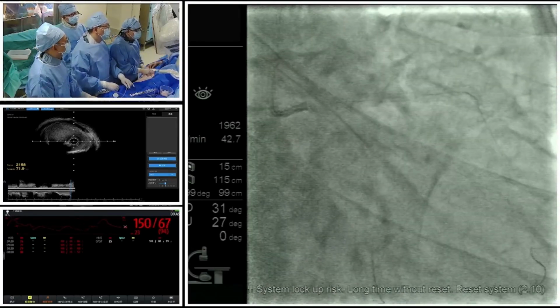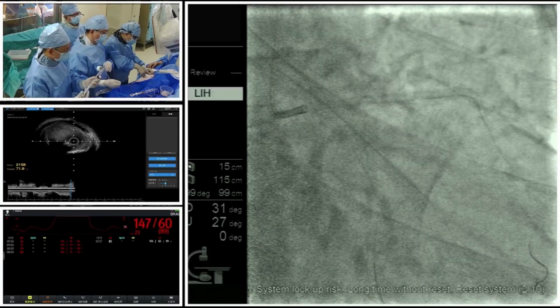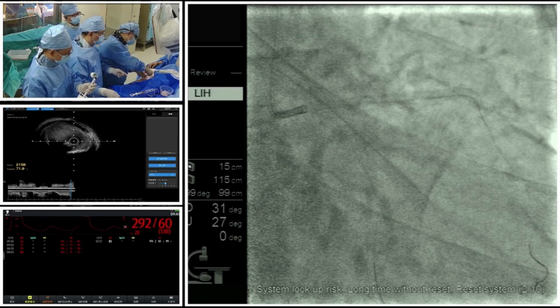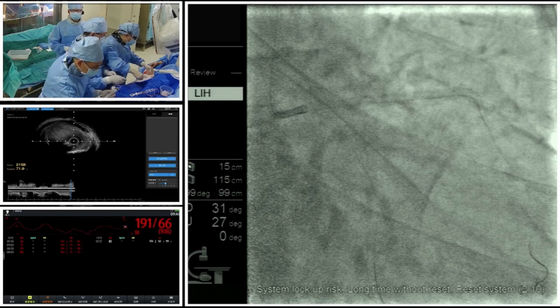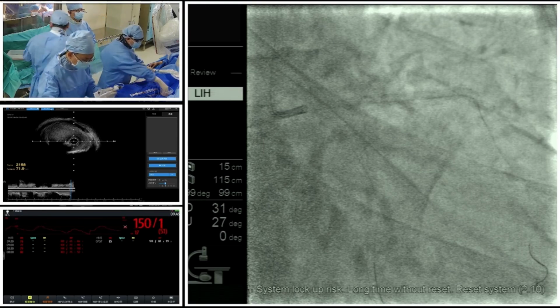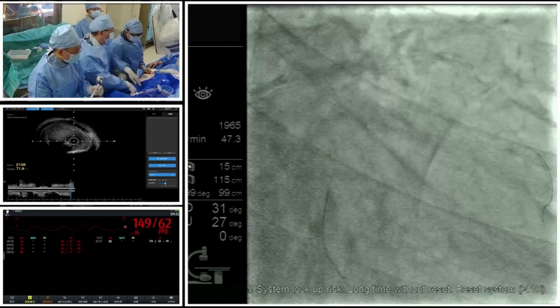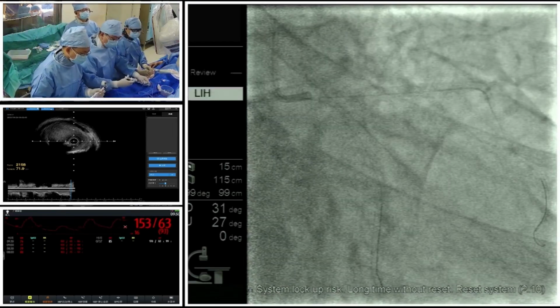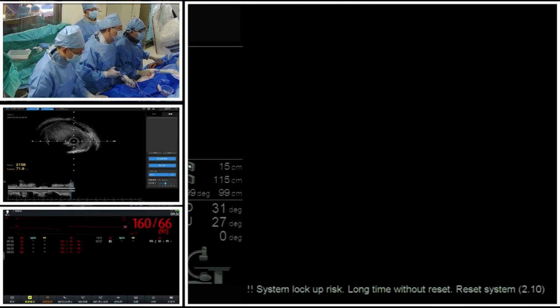As the previous article told us, after a rota and IVL, calcified plaque fractures significantly greater number of fractures after IVL compared with RA.